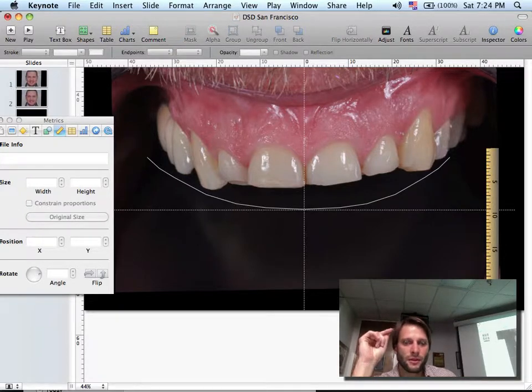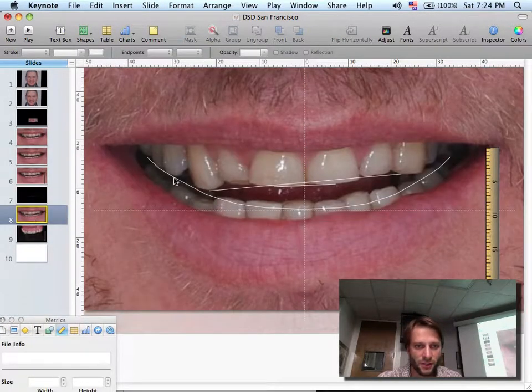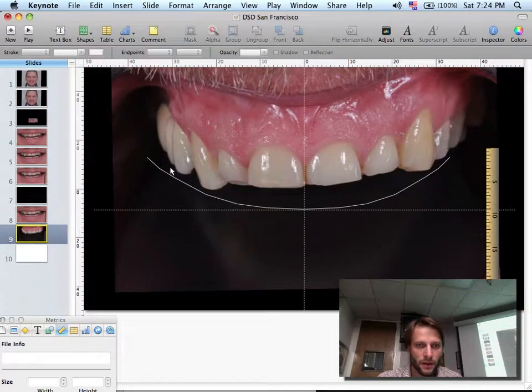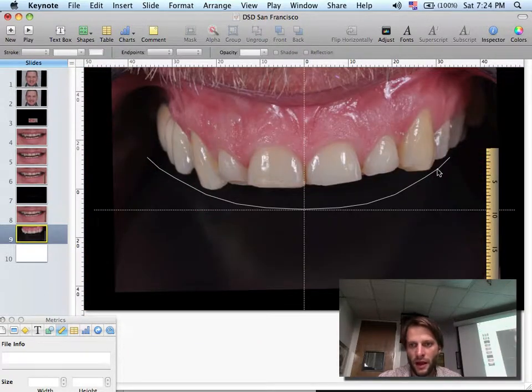The only thing that is missing now to calibrate is the curve. We can see the differences here on the curve. If we look at the curve on this photo, it's touching the bicuspids. Here it's not touching. Here it has some space over here, and here it has less space. So afterwards I will calibrate the curve. How do I calibrate the curve?